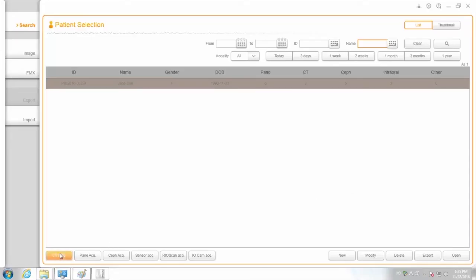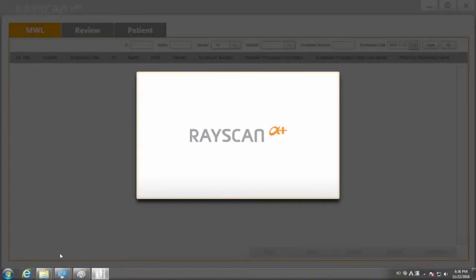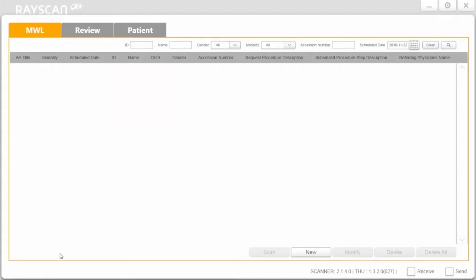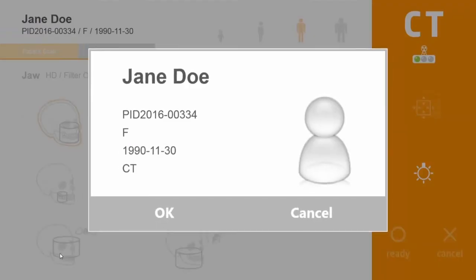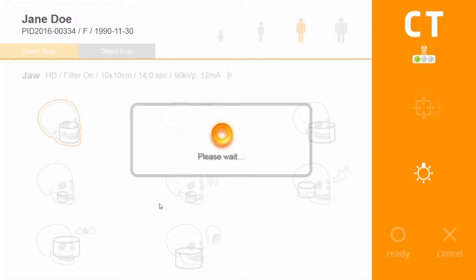Click the CT acquisition button to launch the scanner program. Verify patient information and click OK.